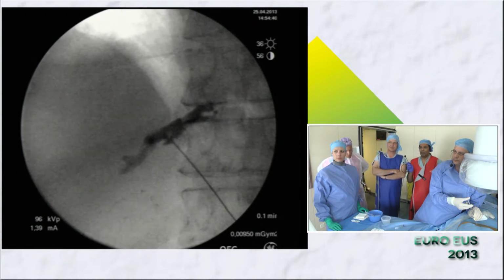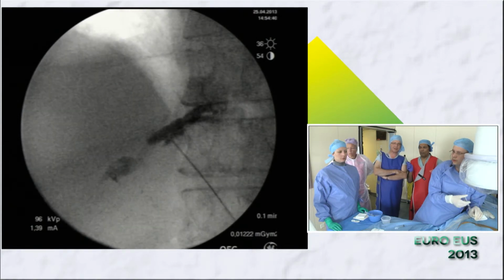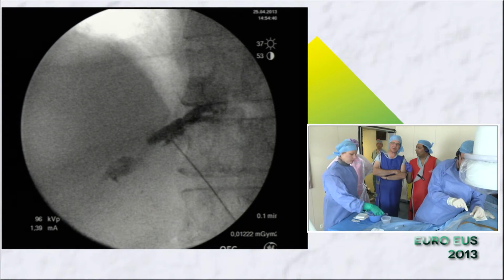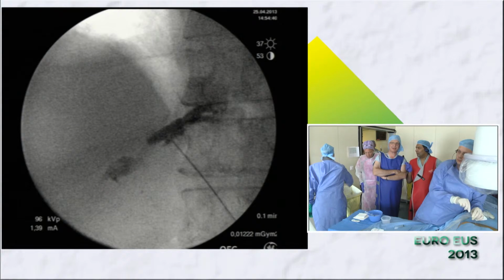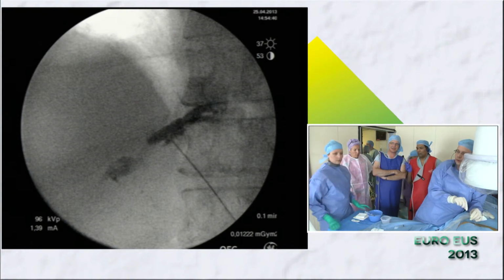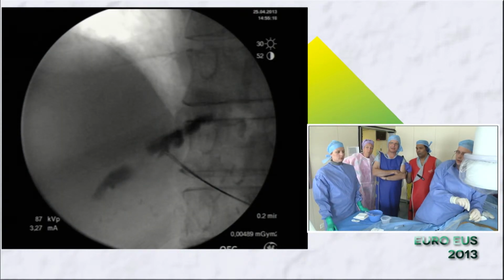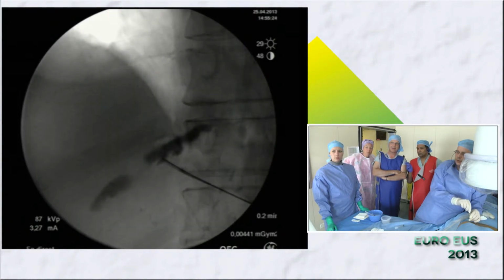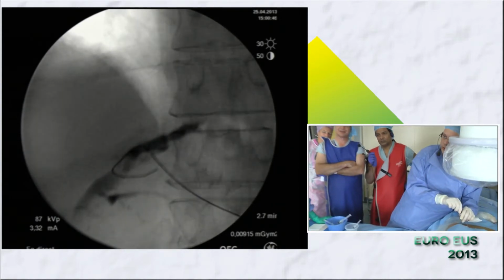Okay. And you show nicely how important it is to come a little bit from the left side, because if you puncture too much in the middle, then you are going in the other direction, and to reach the anastomosis would become difficult. There you can obviously turn to the right. I use a Chiba needle. Okay, that's nice. Better. So I'm not in.